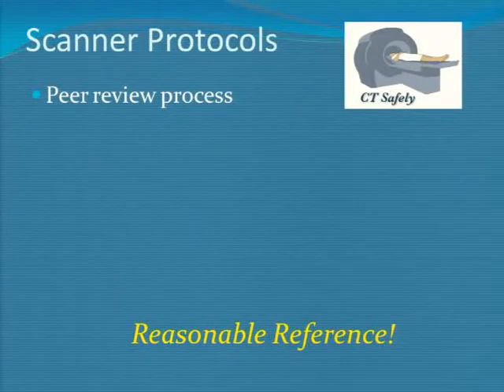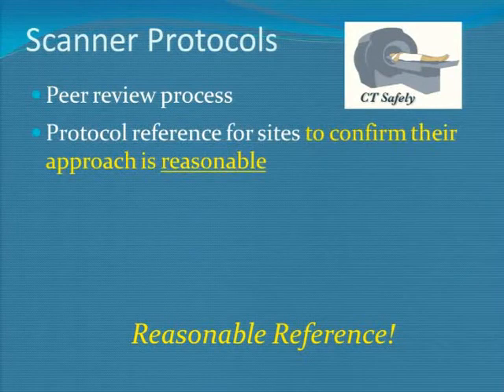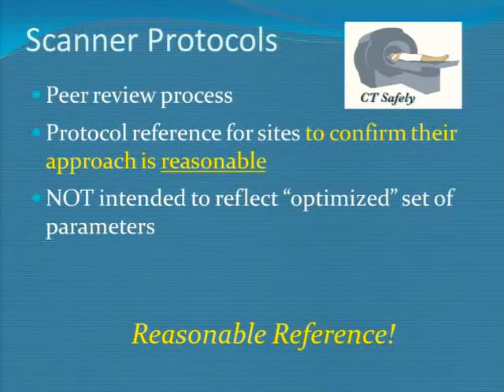These are intended to be sort of reference protocols. This doesn't mean that they're perfect, but we wanted these to be up there so that people could look at their particular scanner model and see what they've got set up and have something to look at to say, wow, are we way off base or are we pretty close? And so that's really what it was intended to be, a reasonable combination of parameters.